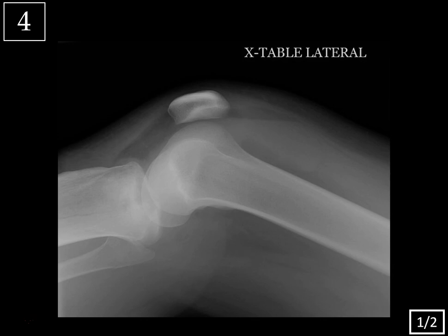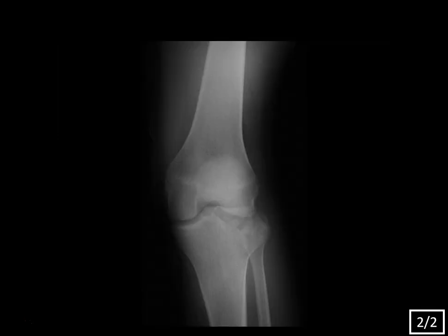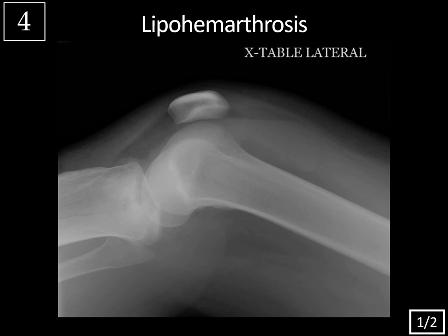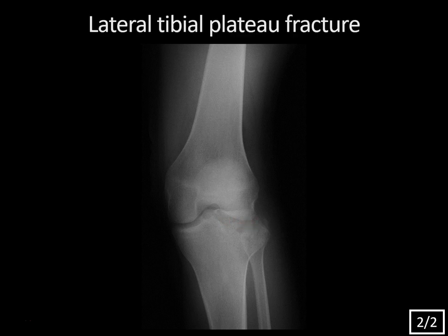Case 4. We're looking at a cross-table lateral view. Here's the patella and the femur, everything looks in normal position, but there's a fluid level indicating lipohemarthrosis. This is typically seen when you have an intra-articular fracture and fat and blood escape from the bone marrow into the joint. You'll see this most commonly about the knee, most typically associated with a tibial plateau fracture or distal femoral fracture. On the frontal view, there is a comminuted fracture of the lateral tibial plateau with some depression.